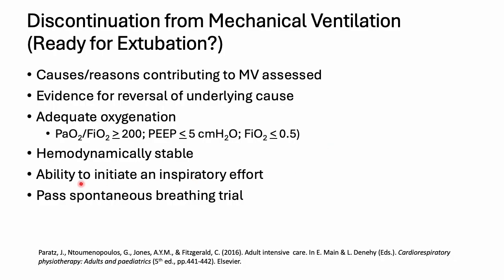The patient should be hemodynamically stable, because the moment the machine is removed, the positive pressure within the lungs is removed, and the effects on the cardiovascular system can make a difference. The point about being able to initiate an inspiratory effort is a no-brainer. And the patient must be able to breathe spontaneously on a spontaneous breathing mode. All that makes common sense.